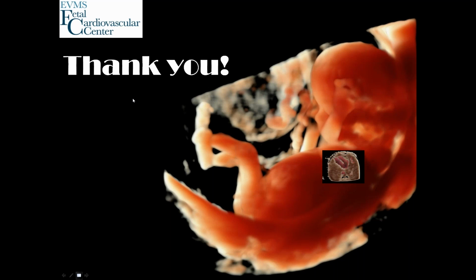So if you're considering using Doppler, you need to use color Doppler first, and spectral Doppler, frankly, we don't use very often. We confirm the presence of tricuspid insufficiency, and usually it's pretty obvious on the color. If this is the case, that could definitely be beneficial to the patient. But the key is to adhere to the recommended ALARA principle and the recommended levels of the mechanical and thermal indices. This is very important.